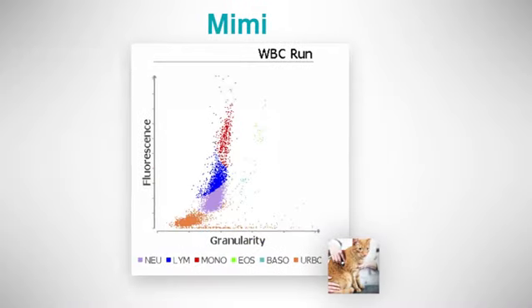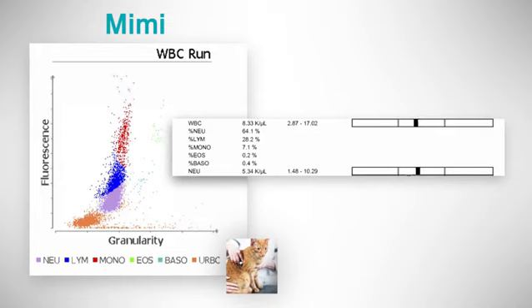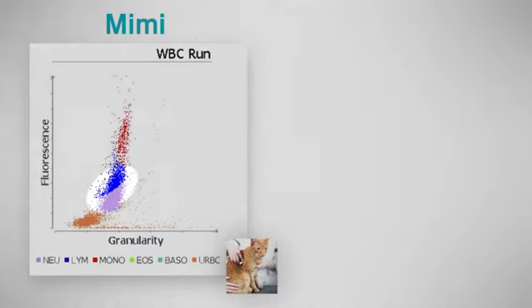This additional WBC dot plot information is critical to remember and identify, as in some cases, such as Mimi's, the reported numerical values for the total leukocyte count and neutrophil count may be within the reference interval, and without recognizing the abnormal pattern associated with inflammation, clinically important inflammatory disease can be missed.